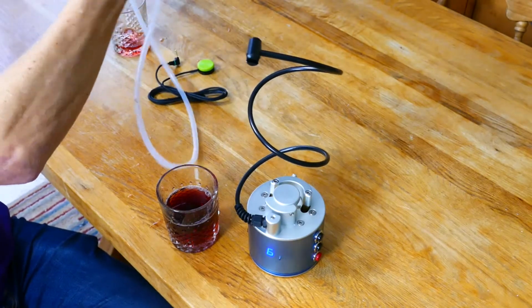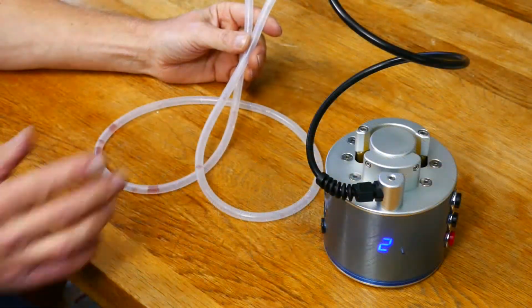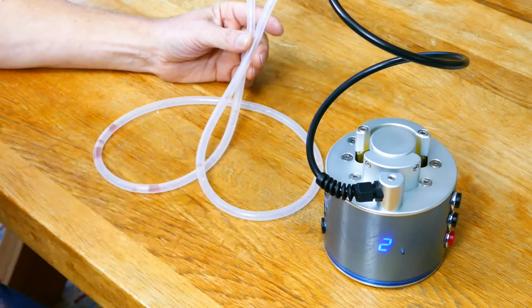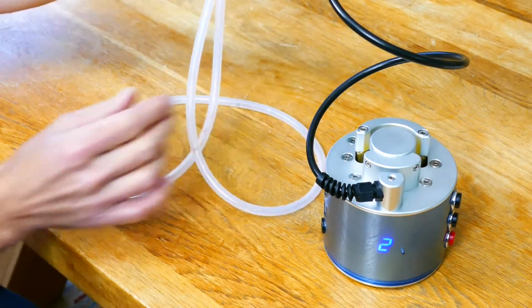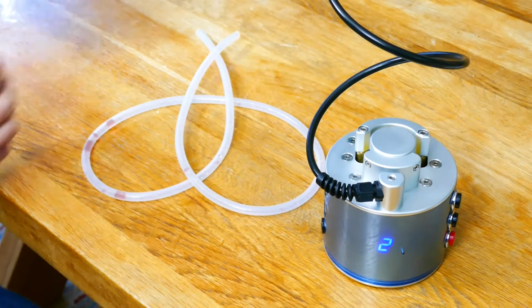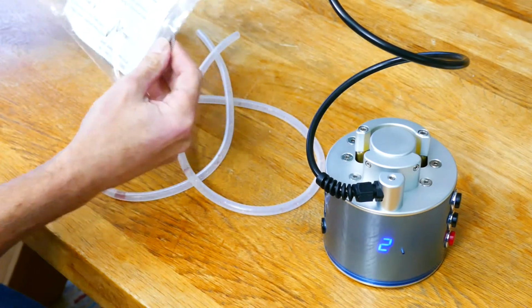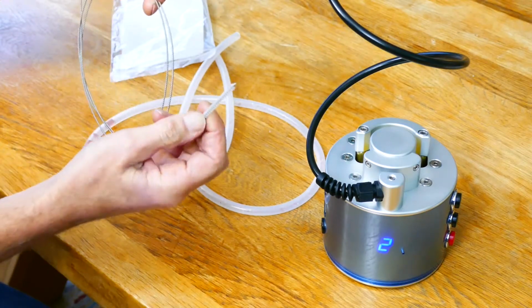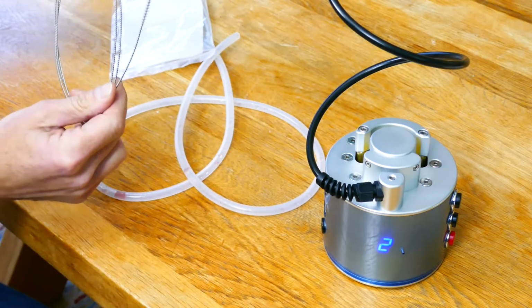There we go. It is a good idea to take the straw straight to the sink and give it a rinse out. As you can see, there are remnants of the drink in here. So I'm just going to go and do that now. We also supply a straw cleaning brush, which has a little fuzzy end on it, which will go all the way down the inside of the straw to give it a scrub as well.